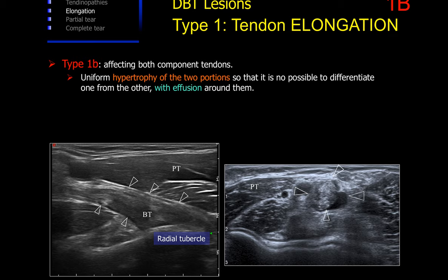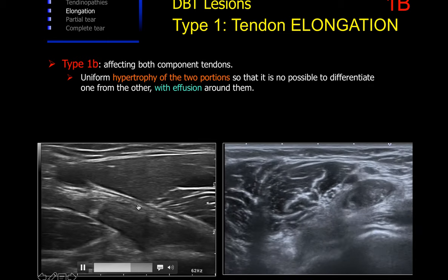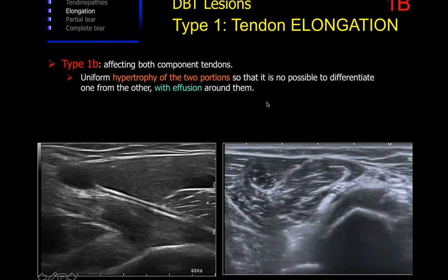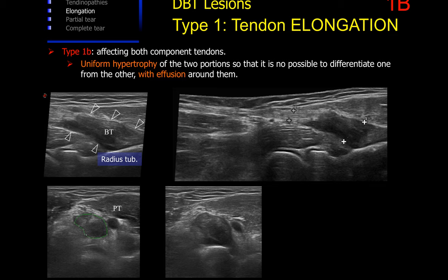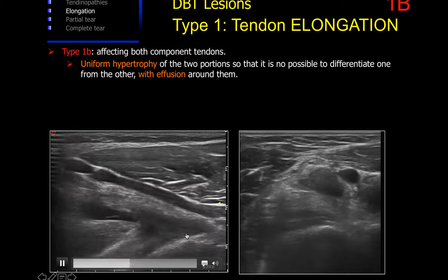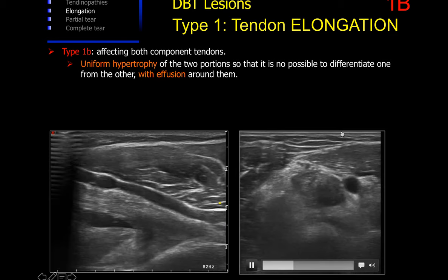Type 1b corresponds to elongation injuries that affect both tendon components. On ultrasound, a uniform hypertrophy of the two portions of the tendon can be observed; it is not possible to differentiate clearly both components. We can see in both the short axis and the long axis the enlarged and hypoechoic tendon. In both planes, the continuity of the tendon onto its insertion and effusion surrounding the tendon can be clearly observed.